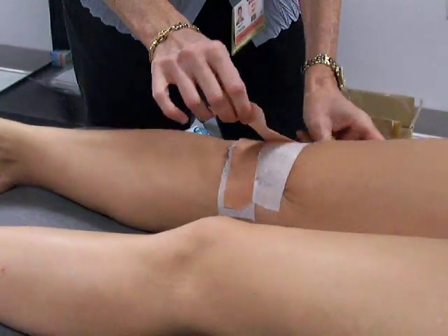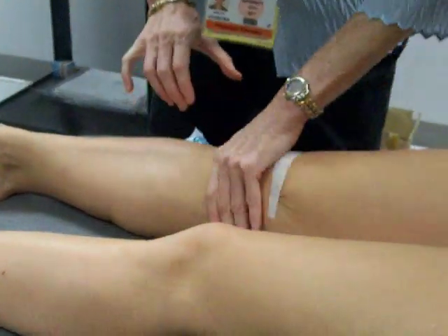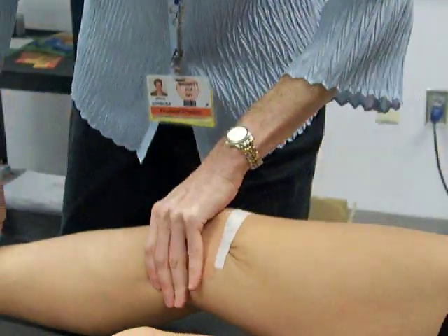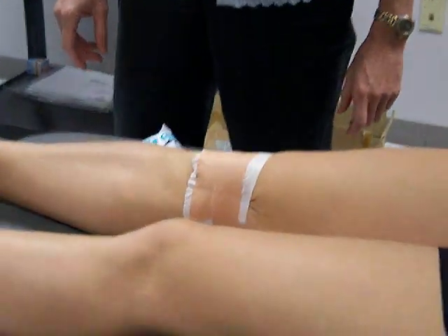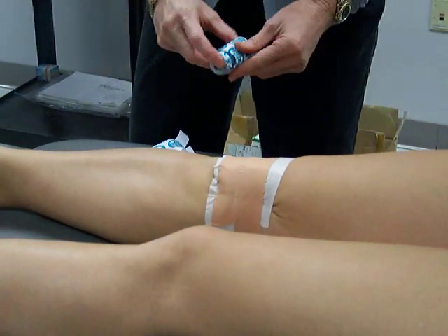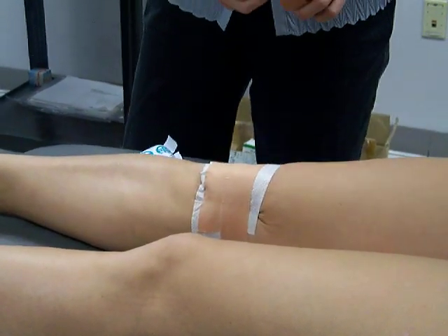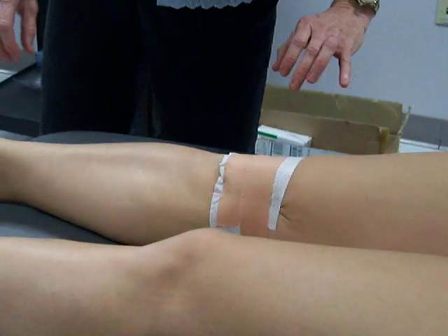Push the kneecap, pull the tape, and lift down. It will be tight. Sometimes I hold it and have them bend the knee two or three times so it stays on, then have them stand up on it. So that's your McConnell taping — it's with cover roll and what's called leukotape. If you want to practice over Thanksgiving, you can use athletic tape, which you can get for three or four dollars at Academy.